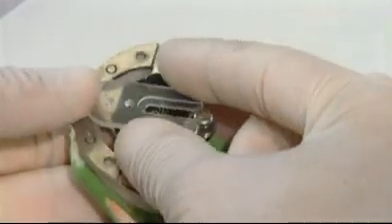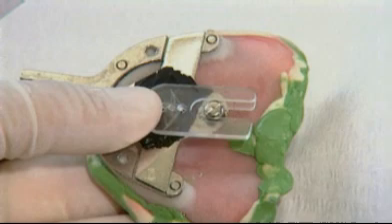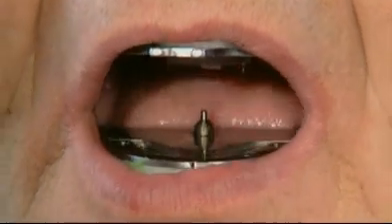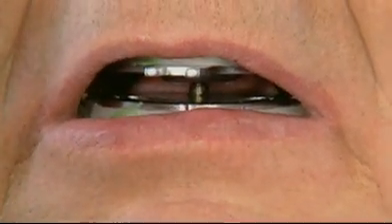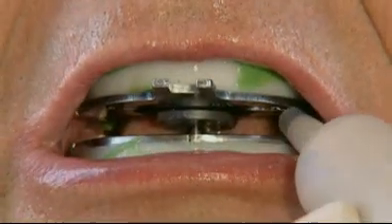To carry out the final check and to secure the registration, place the securing lamina on the registration with one of the openings located above the needlepoint centric tracing. Perform a visual check in the oral cavity by means of repeated closing movements to make sure that the registration pin slides into the corresponding opening of the securing lamina. Confirm the position by having the patient repeat the closing movement several times.